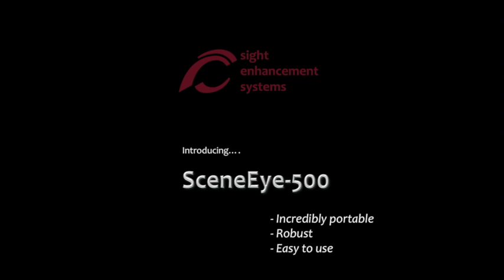Introducing the SceneEye-500 camera from Sight Enhancement Systems. Incredibly portable, robust, and easy to use.